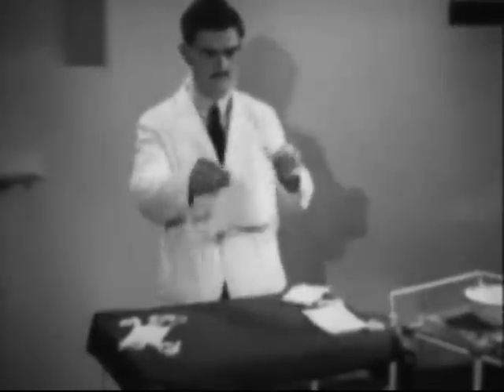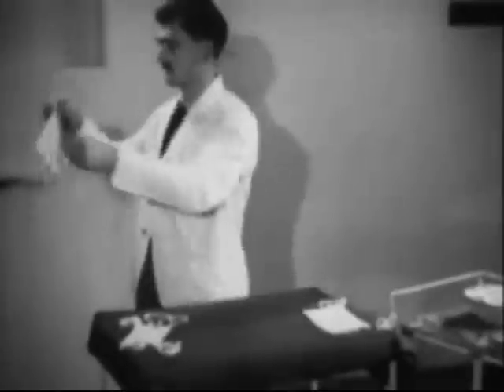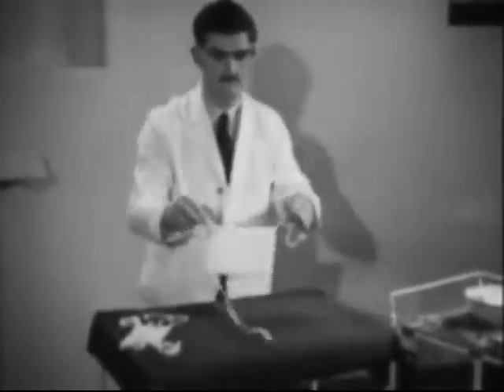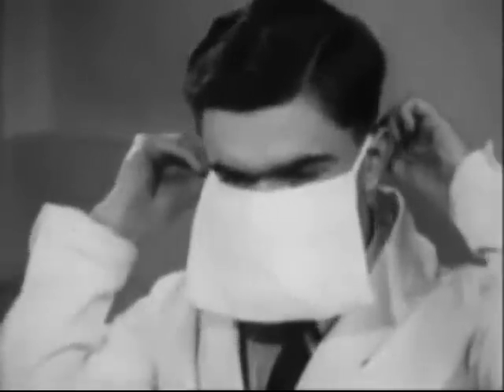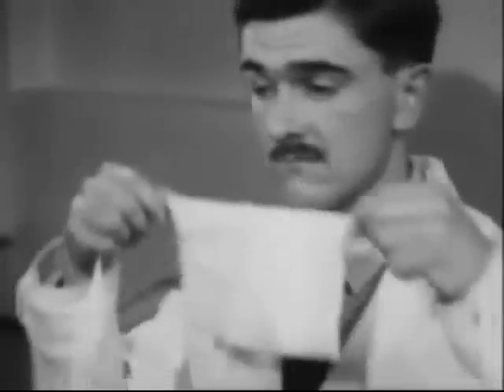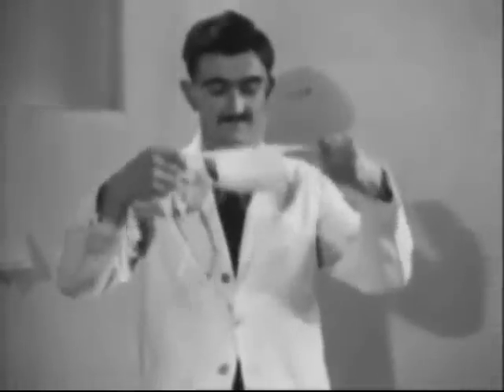Now let's take a look at a few really bad masks. This one, which you can see through, obviously will not hold back droplet spray. And one like this, which has no lower tapes, is bad, because the droplets can fall down, especially when you lean forward. Oh, and of course, to wear it under your nose is senseless. And this, well, it's ridiculously small.